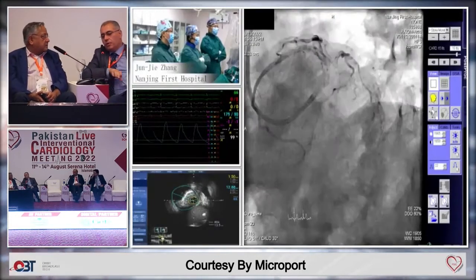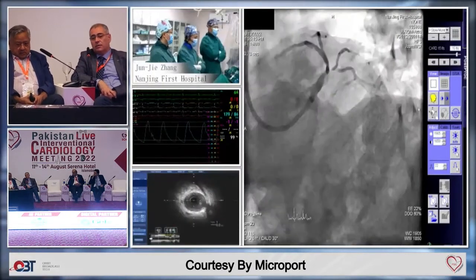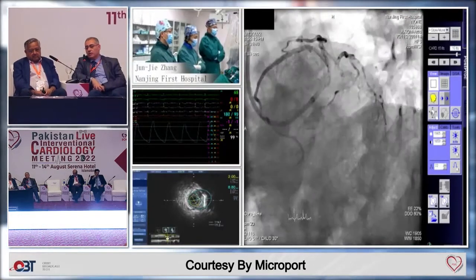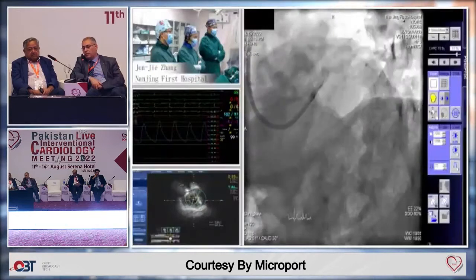We have a huge amount of calcification, so we should do some kind of debulking. It's a must, and we must prepare a shockwave lithoplasty balloon. In fact, it's a challenging case, I think, and we have 2 bifurcations, so we must have all the materials ready before beginning this case.